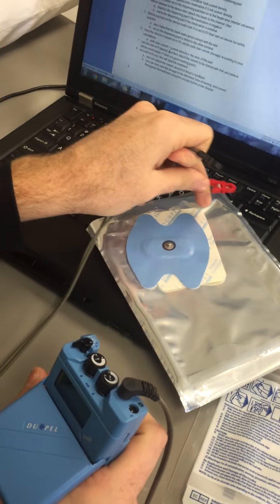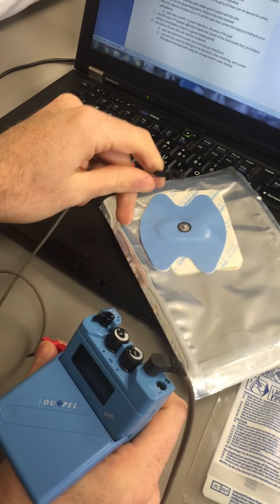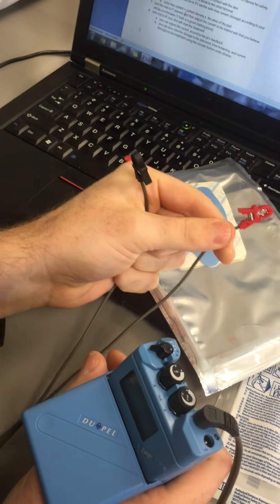The dispersing pad is this white one, and the medication goes on this blue one. So you're going to put acetic acid on the blue pad at the cathode, because it's negative. On the dispersing pad, we'll put the anode.